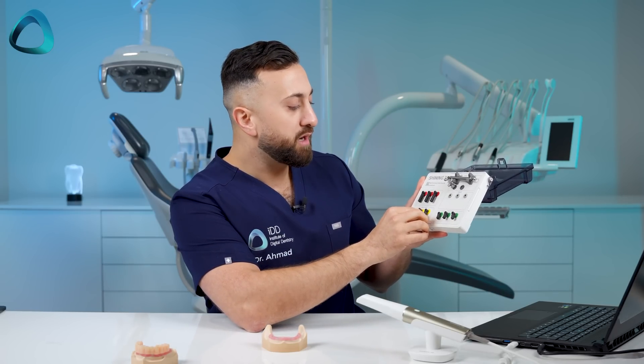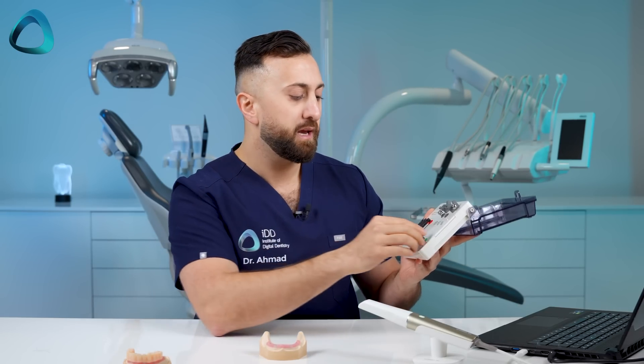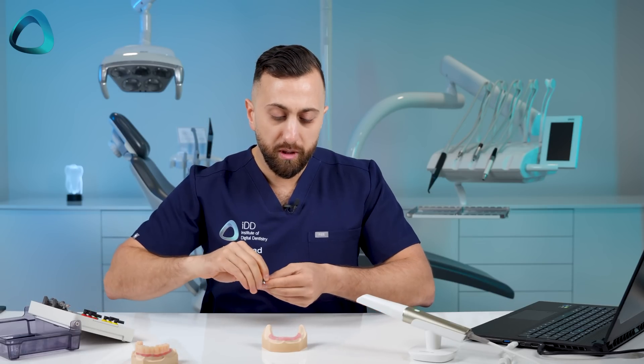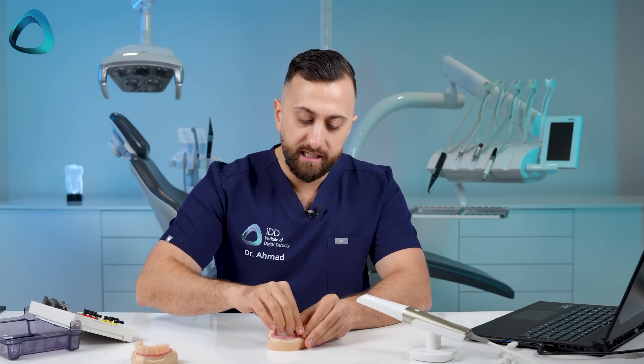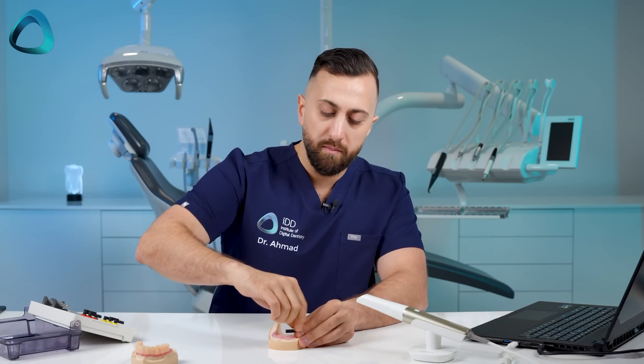Anyone who's read up about full arch implant scanning knows this is where the industry is going — rather than cylindrical scan bodies, we've got these flat, low-profile and long scan bodies, which just helps with maintaining accuracy. What you're supposed to do is take these scan bodies and put them onto your multi-unit abutments. The trick is you want them all facing towards the center of the mouth.